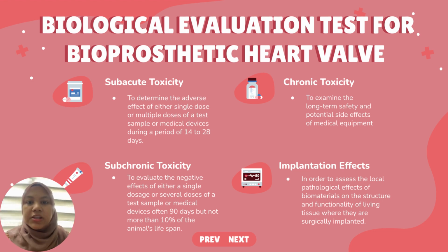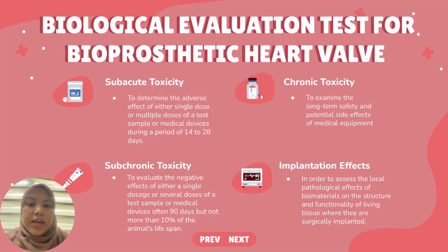Number 7 is chronic toxicity. It's to examine the long-term safety and potential side effect of medical equipment. Number 8, implantation effect. In order to assess the local pathological effect of biomaterials on the structure and functionality of living tissue where they are surgically implanted.